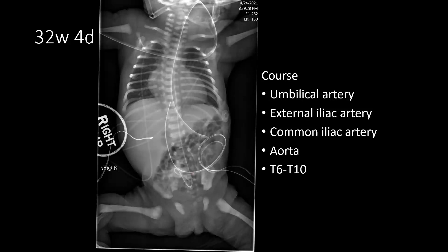Now let's assess the course of an umbilical arterial catheter and differentiate it from an umbilical venous catheter. The umbilical arterial catheter tends to have a loop or a little curl at its beginning where it enters the umbilicus, courses down the umbilical artery to the external iliac artery, into the common iliac artery, and then into the aorta. It then travels up the left of midline within the aorta, ideally to the T6 or T10 level. Notice this patient also has another catheter that has a smooth course going up to the right side of the spine over the liver into the cavoatrial junction — that is our umbilical venous catheter.